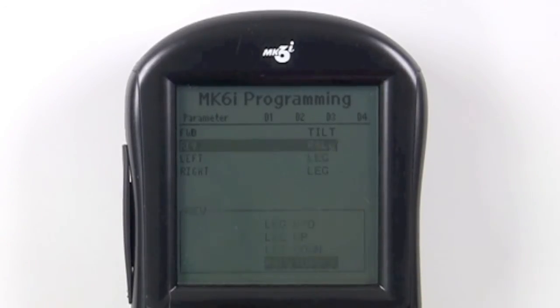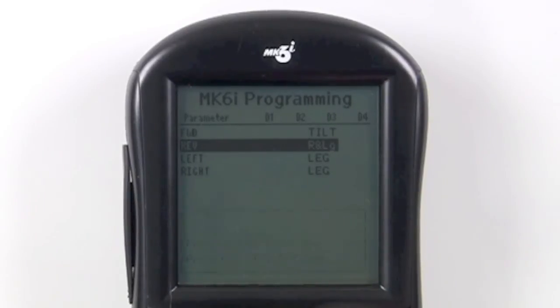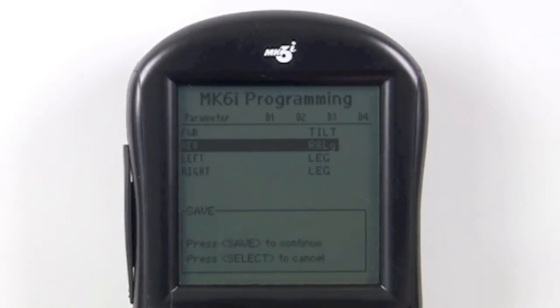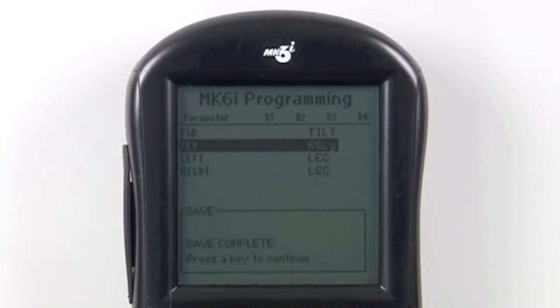When finished, save your changes, and the switch is now ready to operate the way you need.